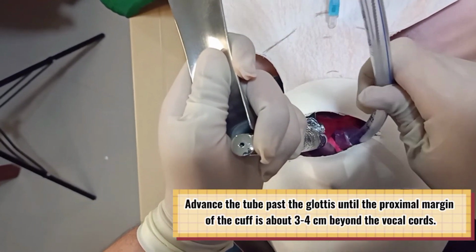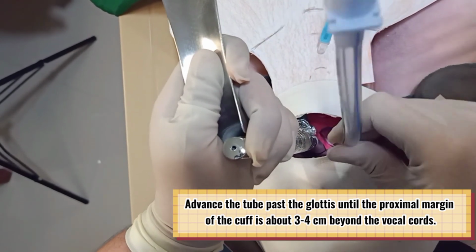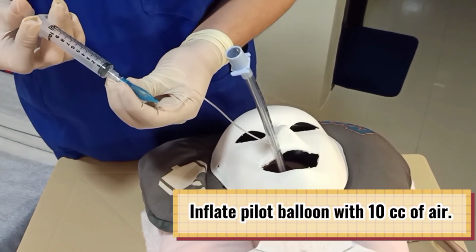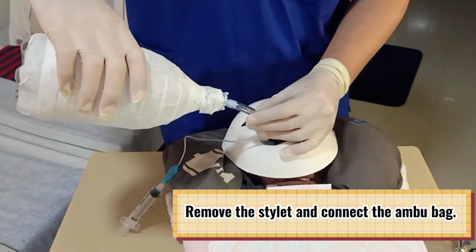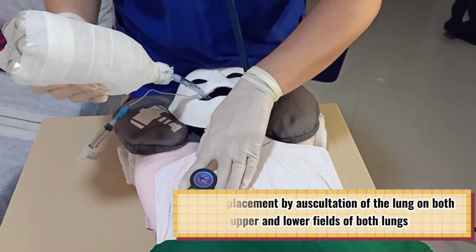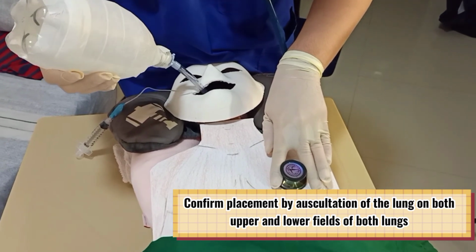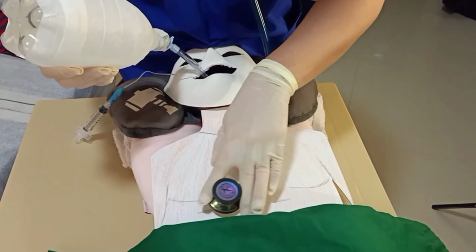Advance the tube past the glottis opening until the proximal margin of the cuff is about 3 to 4 centimeters beyond the vocal cords. Inflate the pilot balloon with 10 cc of air. Carefully remove the stylet and connect the tube to the ambubag or breathing circuit. Confirm placement by auscultation of the lungs for equal breath sounds on both right and left upper lung field and the right and left lower lung field, and check for the absence of gurgling sounds at the epigastrium.